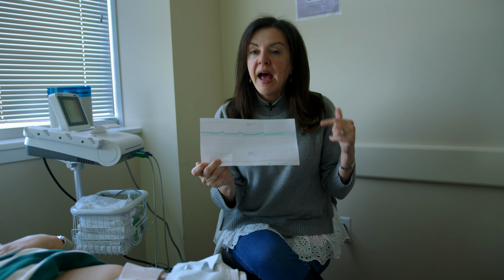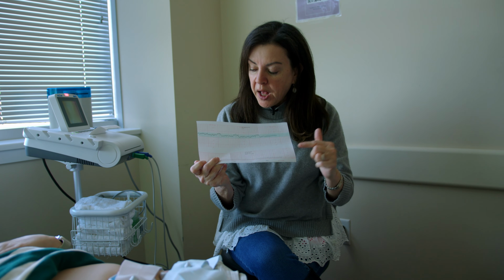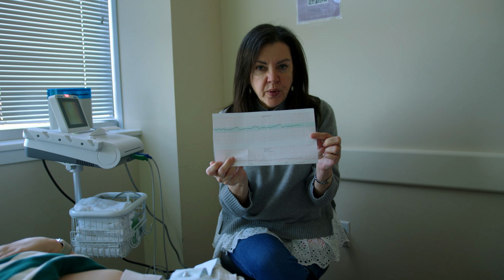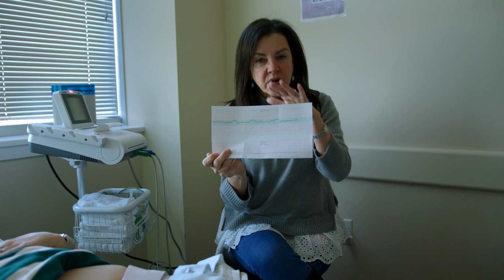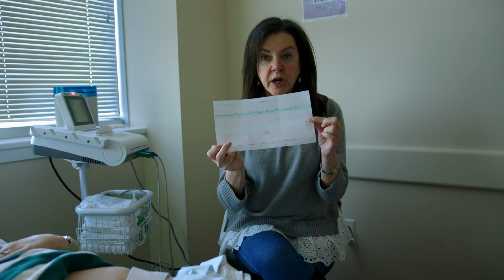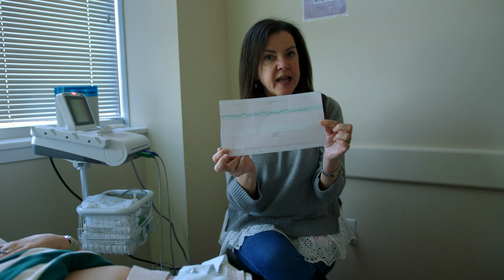And depending on how far along you are in the pregnancy, after you pass 32 weeks, what we ought to see is accelerations in the heart rate whenever the baby moves. And you can see that we're seeing several good accelerations here. What we shouldn't see is a really flat line or dips in the heart rate that occur repetitively. This bottom line is monitoring for contractions, and she's not having any.